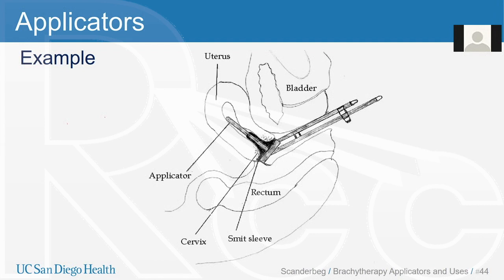So with a lot of needles, that kind of gets smeared out. But with just 2 applicators, the dose distributions from having an incorrect connection will be huge. So I'm hoping this illustrates that just because it seems like an easy procedure, with just 2 applicators, a tandem and ring, you really need to know your applicators, your procedure, and be 100% confident in your planning, your treatment, your connections.